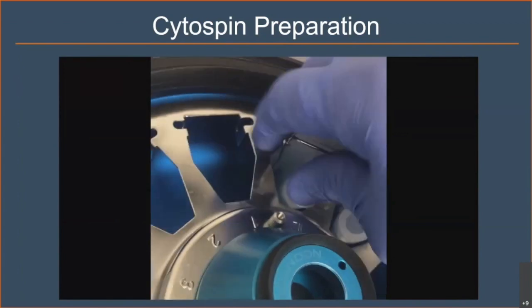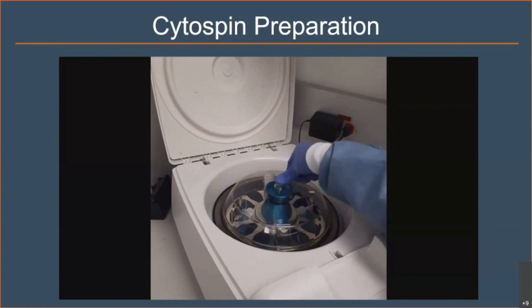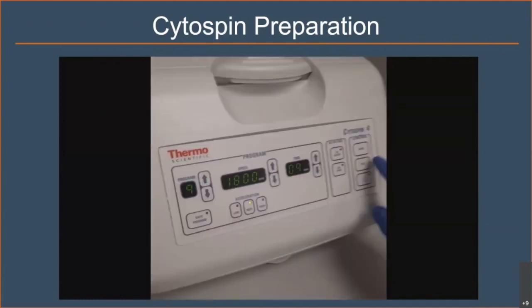Here you can see we have added a drop of saline and the samples are capped. The rotor lid is placed and the sample is spun to allow the sample to be deposited on the slide. Next slide, please.